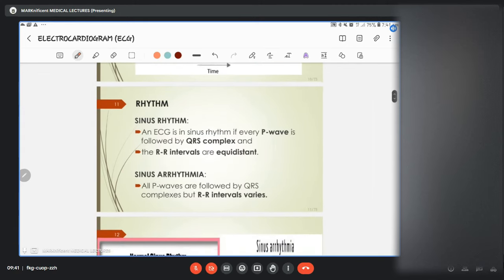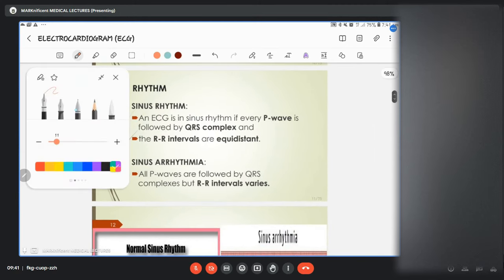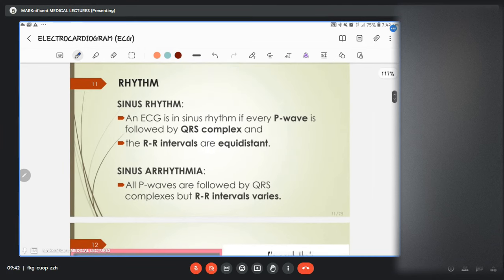Now, the main thing here, this is where you lay your focus as a clinician, because we have a specialty which is called, well, it depends on your country or your region, but here I think they call it medical technicians, that can analyze all of those things in detail. Yours is to make the diagnosis. So this is where your focus should be. From this page I'll try to explain. So we have what we call the reading.